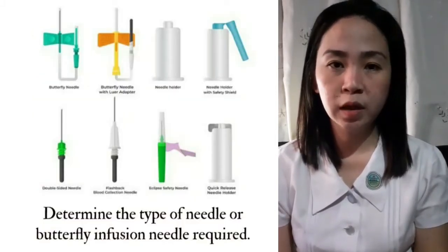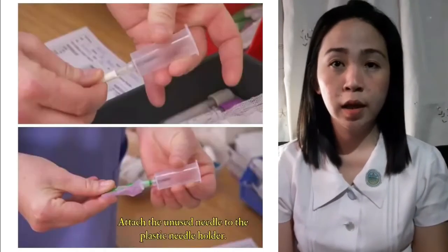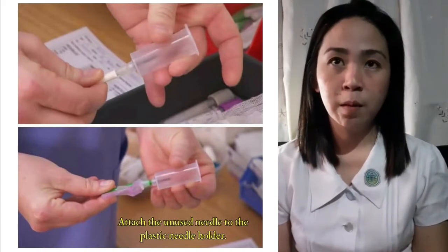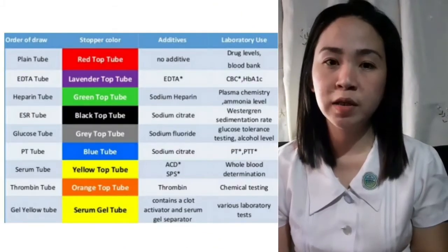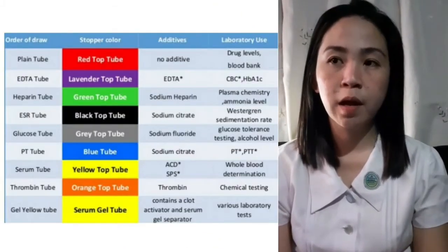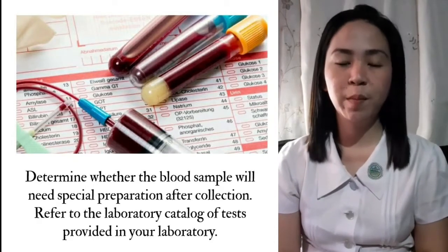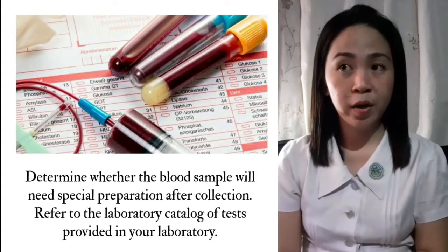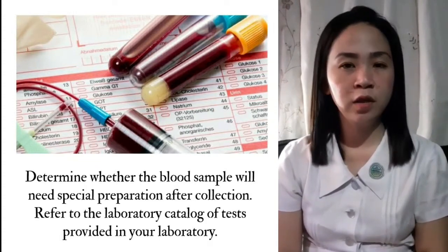Determine the type of needle or butterfly infusion needle required. Then attach the unused needle to the plastic needle holder. Select the appropriate blood specimen tube for the test. Determine whether the blood sample will need special preparation after collection. Refer to the laboratory catalog of tests provided in your laboratory.